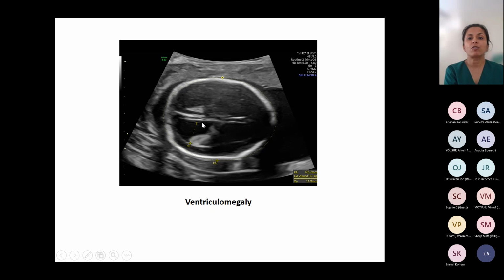You can see a huge ventriculomegaly here. You can see the shape of the skull is abnormal here. This is called lemon-shaped skull, which is associated with spina bifida. Now, intrauterine spina bifida surgery is now offered in the UK, at UCL and at King's as well. So now that is again another huge area where confusion happens for couples as well.